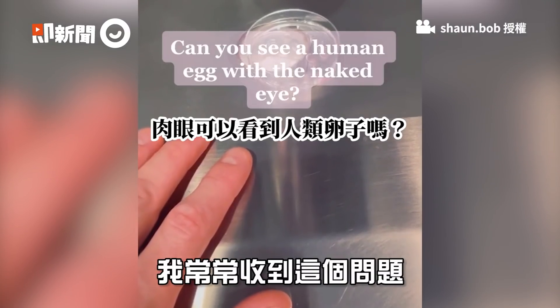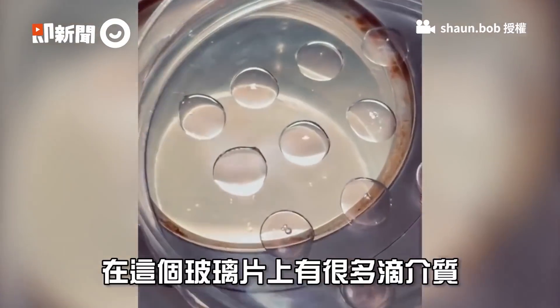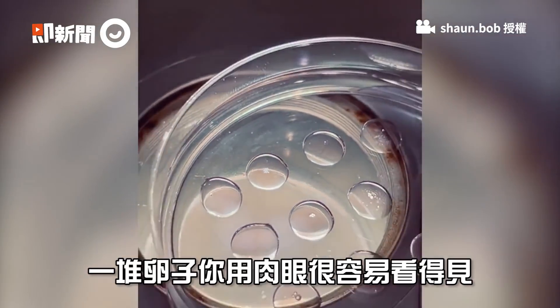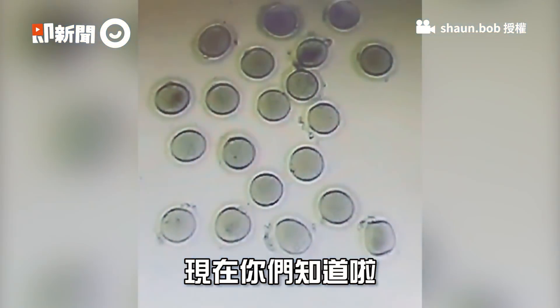This is a question I get all the time, so let's see. There's my hand as a frame of reference — this is a dish with a bunch of drops of media. That drop right there has 20 eggs in it. It's a lot easier to see a group of eggs; just one of them is like impossible to see. That's what they look like under the microscope, and now you know that.